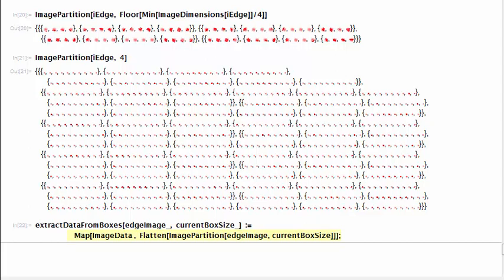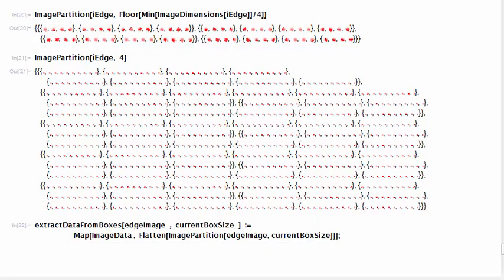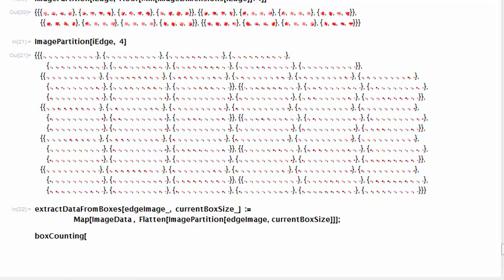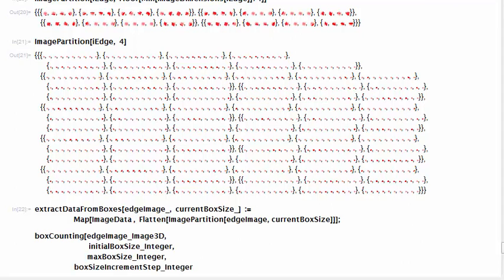Applying image data with map to the list of cubes will give us a list of numerical elements for each cube. The cubes that are empty, the ones without edge elements, will be populated by zeros in this list.